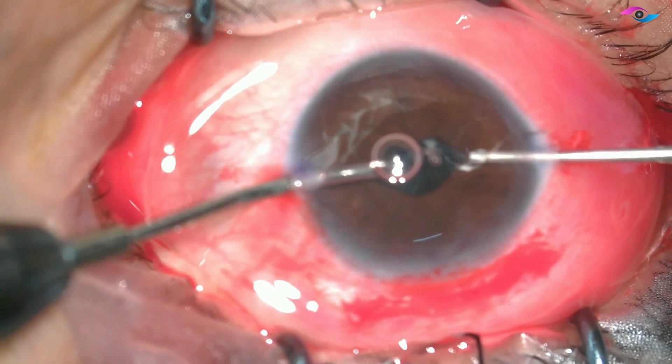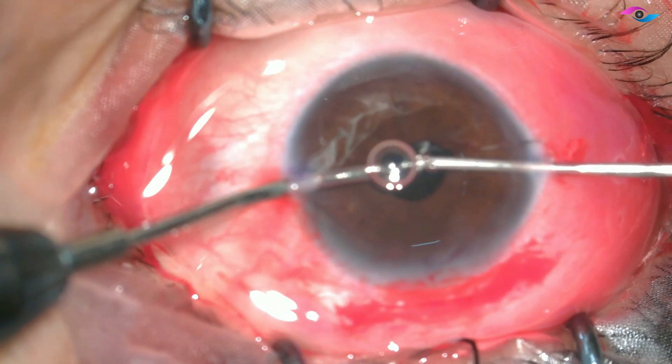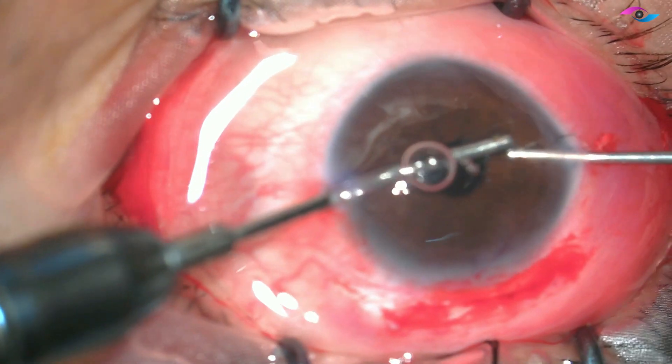I am removing all the vitreous tags near the side port, making sure that the pupil is not peaked anymore and there is no vitreous remaining. Staining the vitreous with triamcinolone greatly helps in this.